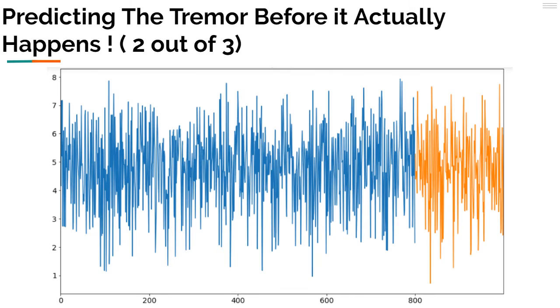Then, with proper smoothening and proper processing of all the observed data, we are able to predict the tremor before it happens, which means you can see on the screen the blue colored ones are the ones which have occurred earlier and the orange colored ones are the ones which are predicted, and we could predict the tremor most perfectly using this model. This is very simple, effective and efficient.